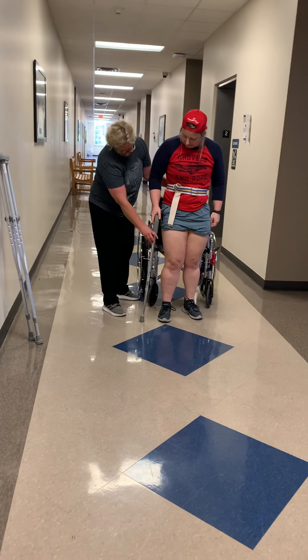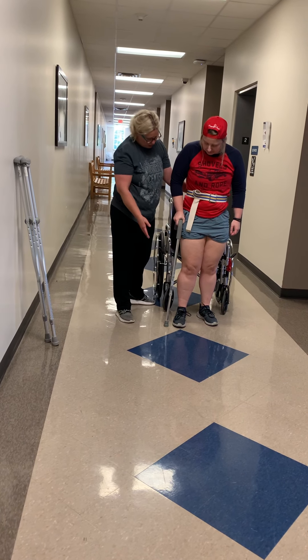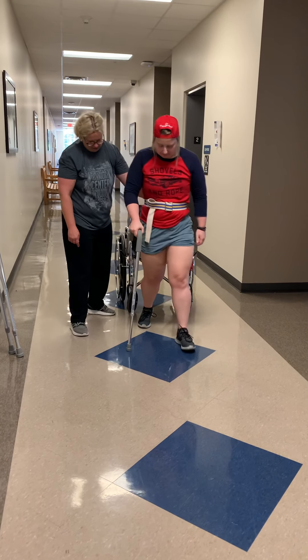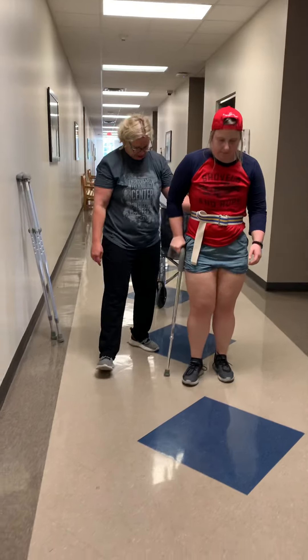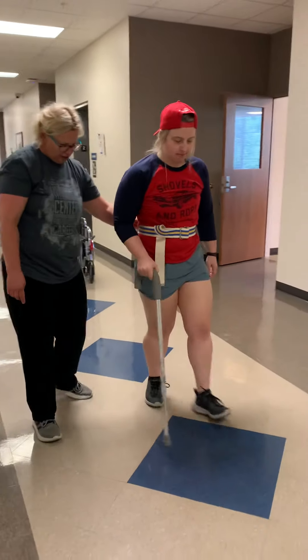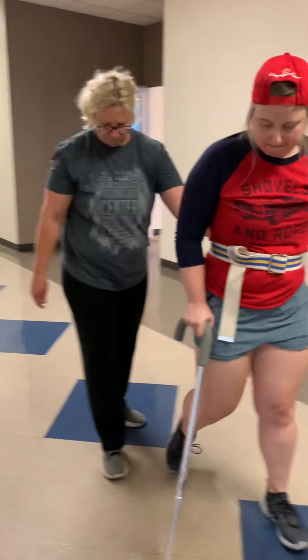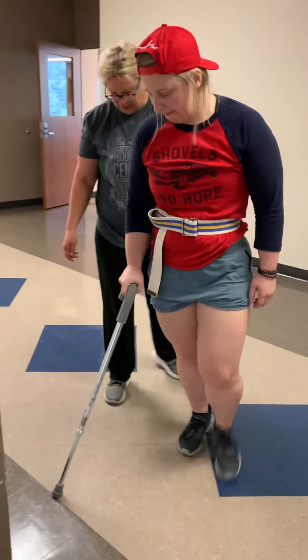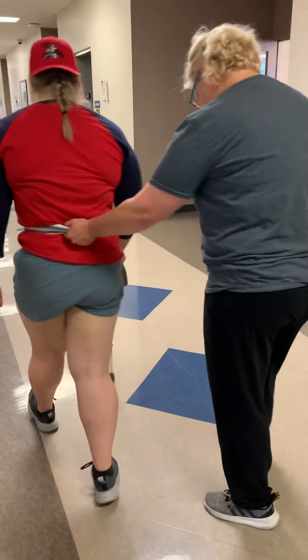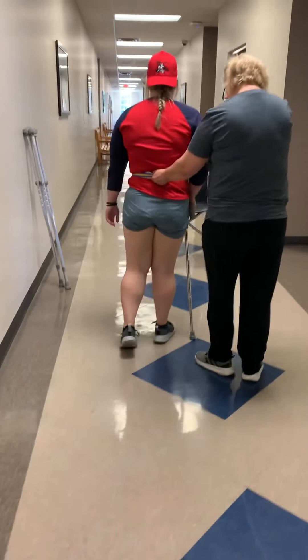Let's go ahead. How does that feel there? Looks pretty good. What I'm going to have you do is advance that cane and step with your left leg. There — there you go. Is that feeling all right? Let me get up here. Let's try and see if we can turn to your right here. Let's head on back. All right, there you go. You're doing great.